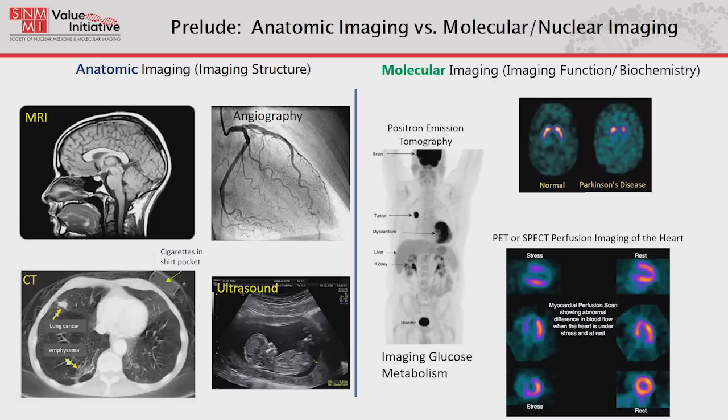You can see the kidney actually recognizes the radioactive glucose we injected as an imposter, so the kidney's actually filtered out, and it goes down to the bladder, which you kind of see down there. That's normal physiologic uptake. What you see in the upper right is a DAT scan. This is a SPECT scan, where you inject something that goes into the presynaptic dopaminergic system. They use this for differential diagnosis of Parkinson's disease from other motion disorders. And in the lower right-hand corner, you see some cardiac perfusion scans that look at blood flow to the heart to look for people who have cardiovascular disease.